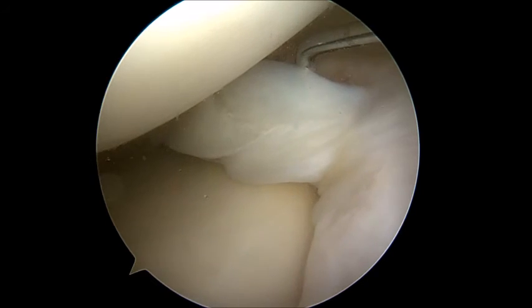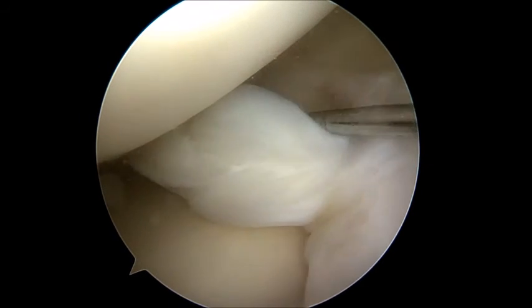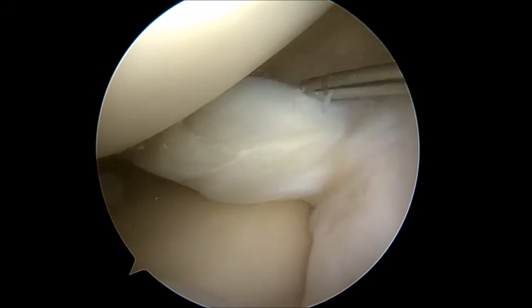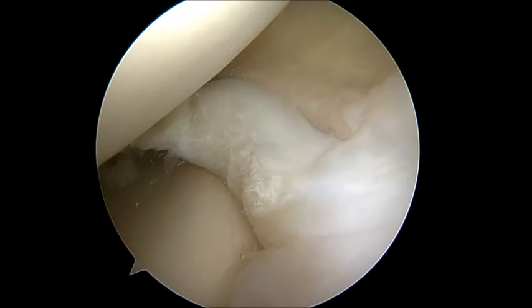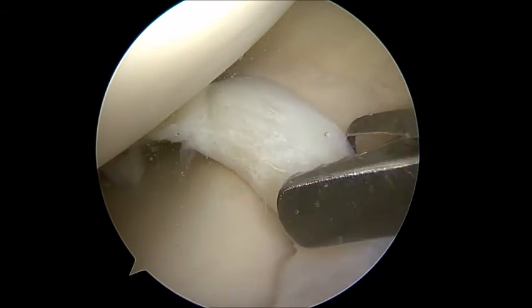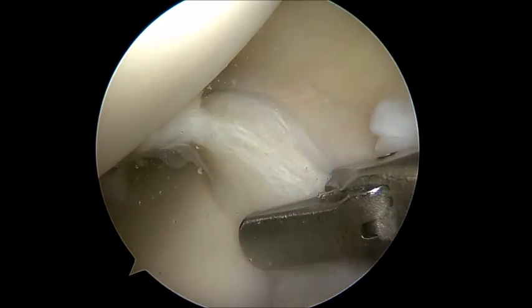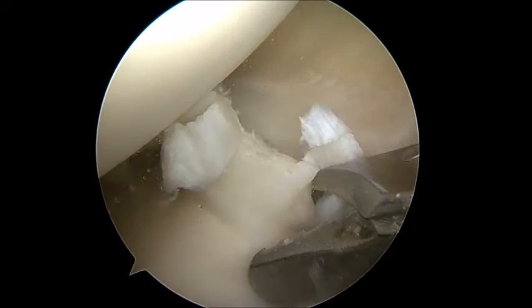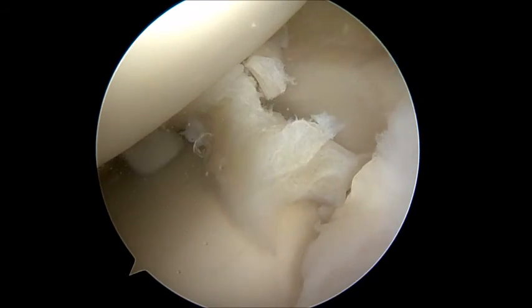Here, a probe shows the attachment site at the front edge of the tear, where it inserts onto the normal meniscus. After the attachment site at the back edge of the tear is cut, the front attachment site is then cut in a similar fashion using an arthroscopic scissor-type device seen here.